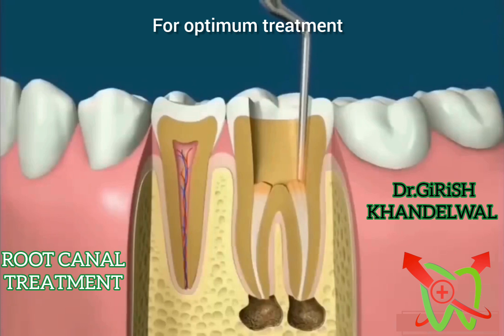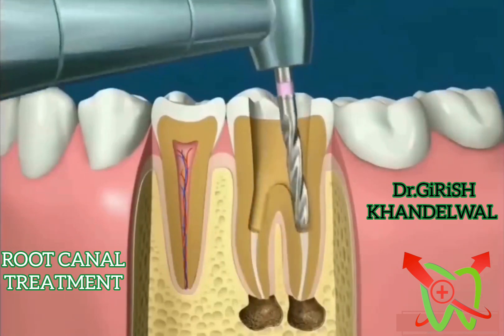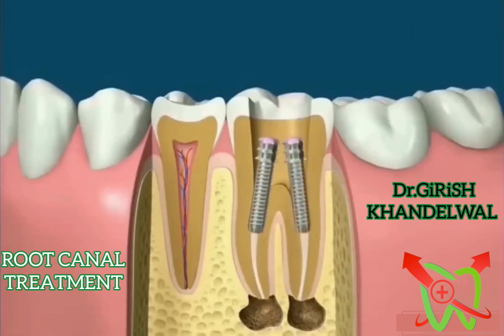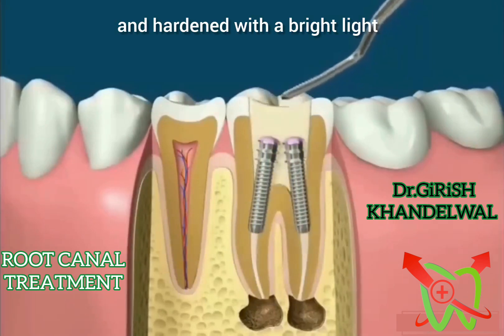For optimum treatment, one or more posts may be placed to strengthen the tooth and retain the filling. In this case, a light-cured resin is used to fill the space. It's soft when placed in the tooth and hardened with a bright light.